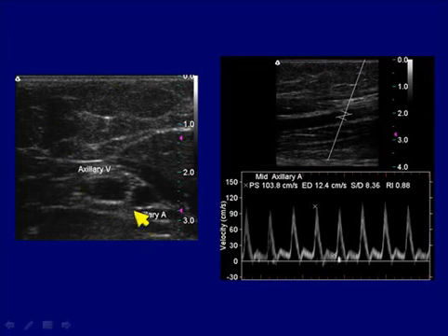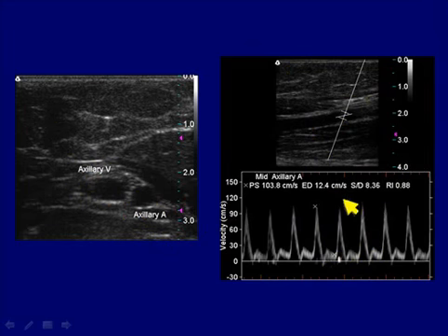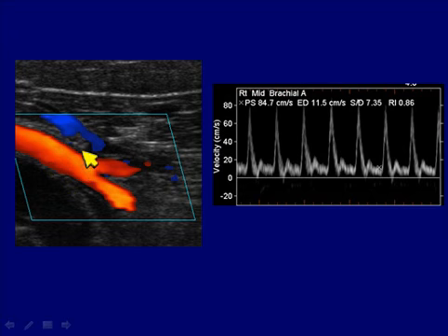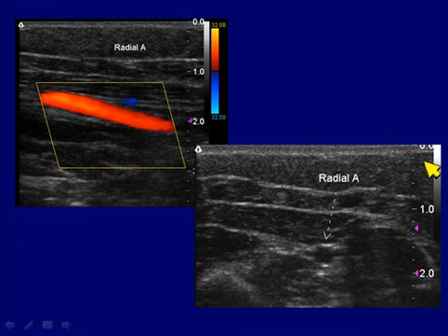Continuing out the arm, we want to see nice paired veins with a companion artery. Here's the axillary artery and vein with the Doppler placed in the axillary artery, showing a peak velocity of around 100 and a multiphasic high-resistance pattern — exactly normal. Further down the arm, we follow the brachial artery. The brachial is very important because some surgeons create dialysis fistulas using that brachial artery as an inflow source for a basilic vein transposition. We need to pay close attention, measuring diameter and velocities, and here we see a very textbook normal brachial artery waveform.